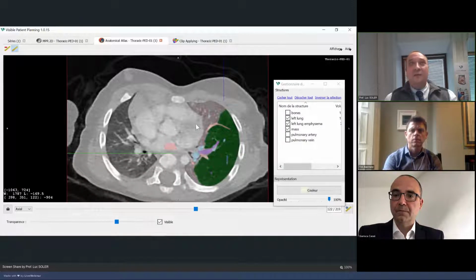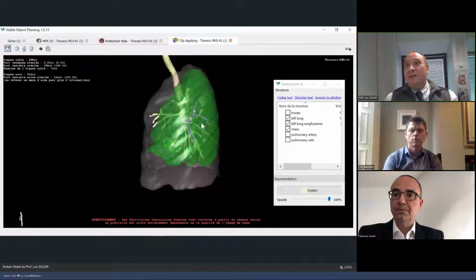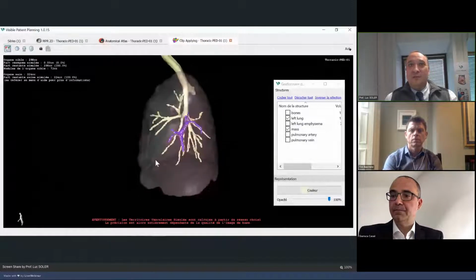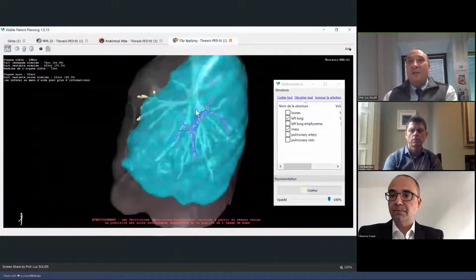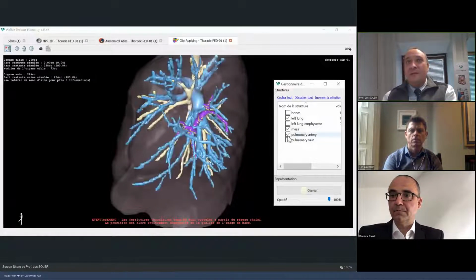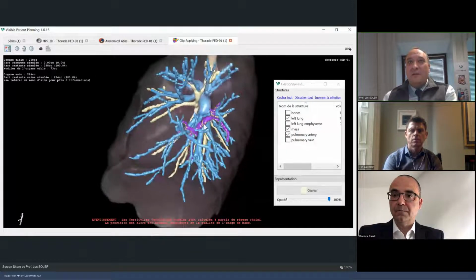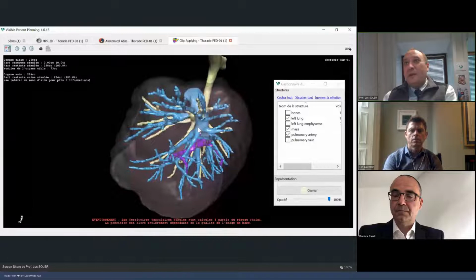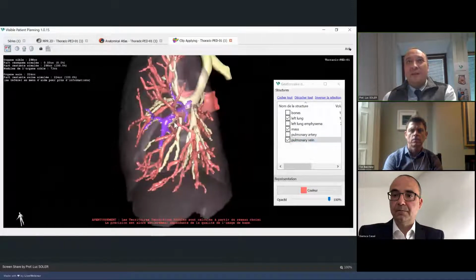And this additional tree is the bronchus system that you can see here inside this tree, that is the additional branch. So the surgeon resected this tree with the associated arteries. So you can see that there is a dedicated artery here. And so he has resected this branch, and with the associated vein, because it also has a dedicated vein, as you can see here.